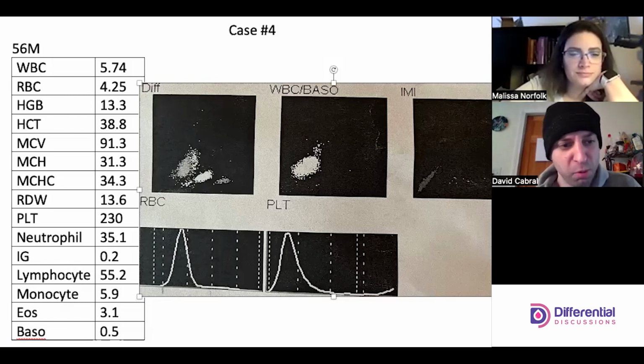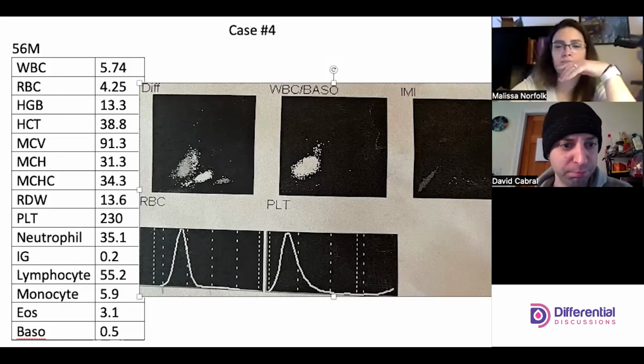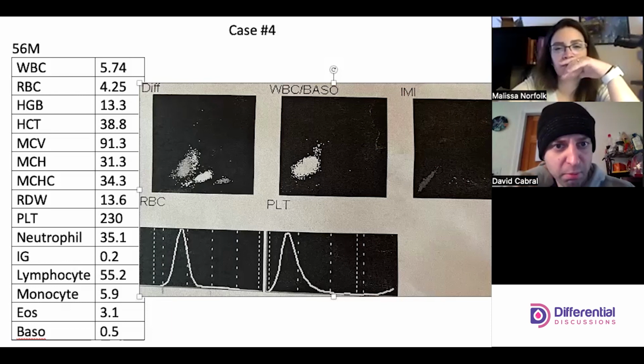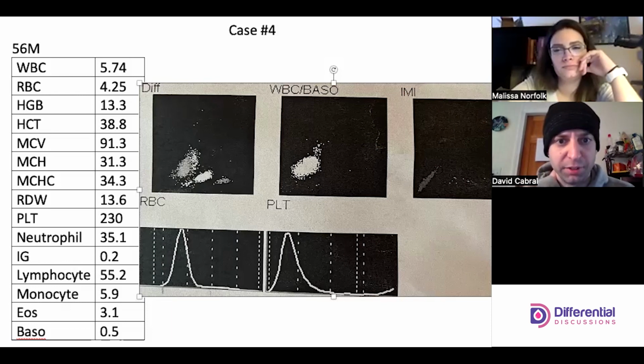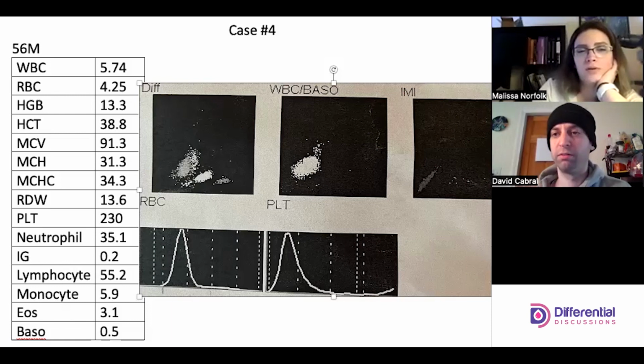neutrophils. So we have slightly more lymphs than neutrophils. And I'm looking at my histograms. Red cell histogram looks beautiful. Platelet histogram looks pretty good. And in the diff channel, I can see my lymphs. I can see a small monocyte population probably, and very, very rare, probably occasional reactive lymphs in the diff. There are EOs and neutrophils. Okay. I think I'm ready to look at the slide.